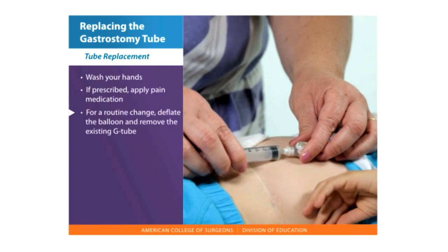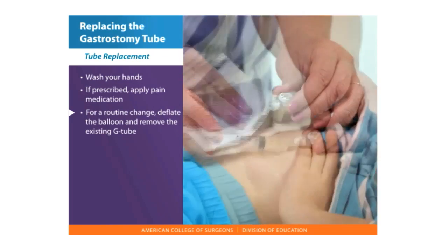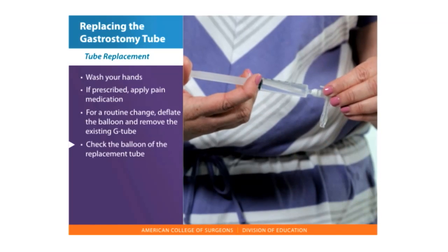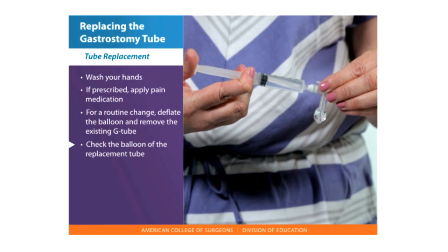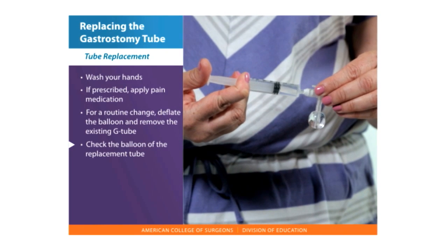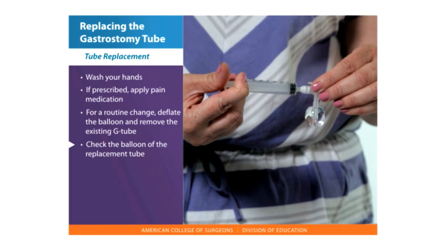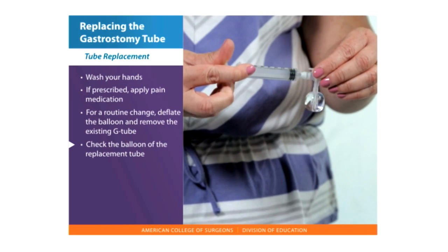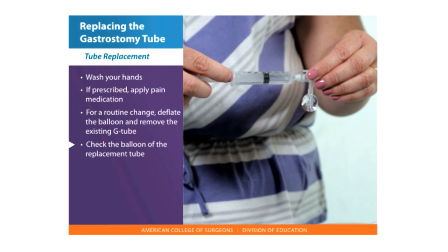If this is a routine change, deflate the balloon and remove the existing G-tube. Check the balloon of the replacement tube by injecting the same amount of water with a small syringe, usually 5 milliliters. There are two portals on the tube — one is for feeding and the other is for inflating the balloon. Withdraw the water back out to deflate the balloon.